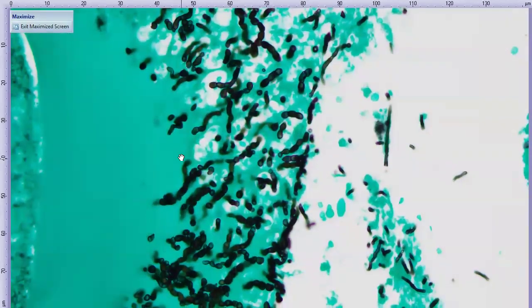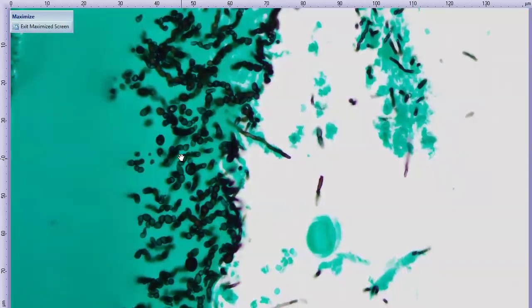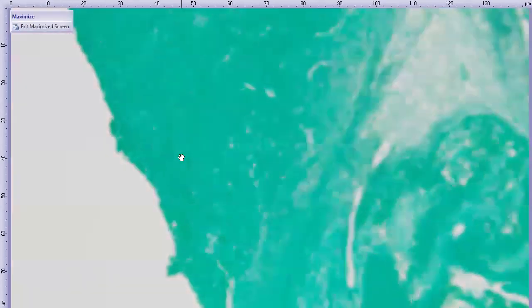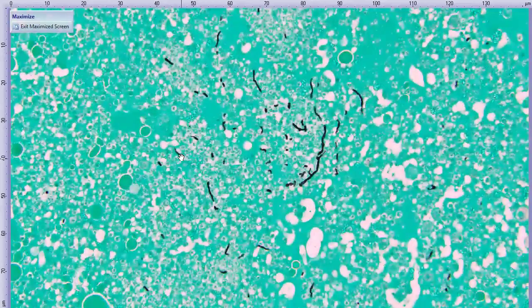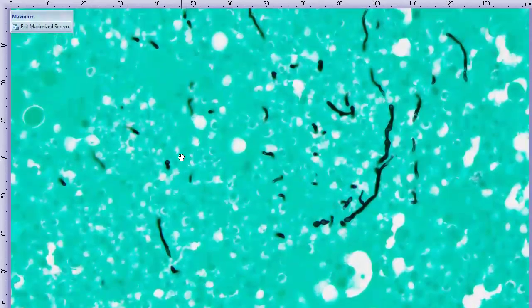We get a little bit larger section of the lens capsule. And so we can see all these fungal hyphae that are lovely, beautiful, awesome looking. And then if we scroll over to our vitreal inflammation, we can see that they are also here in the vitreous as well. So maybe possibly even a higher concern that there might be more systemic issues going on with this cat.